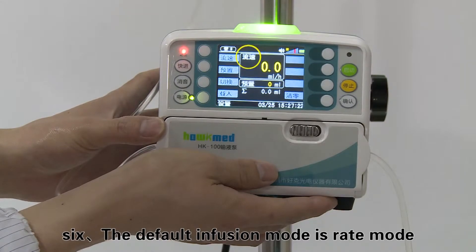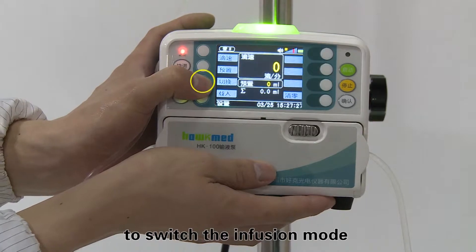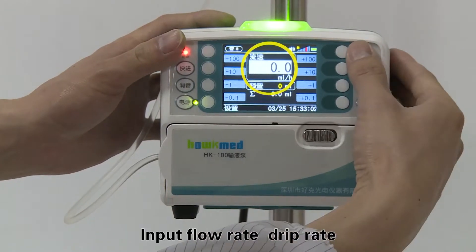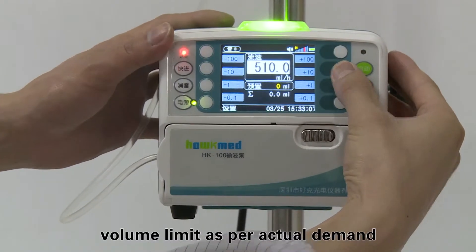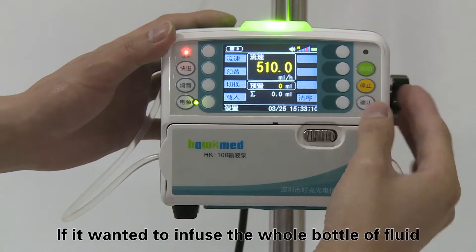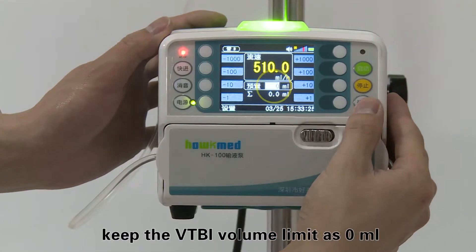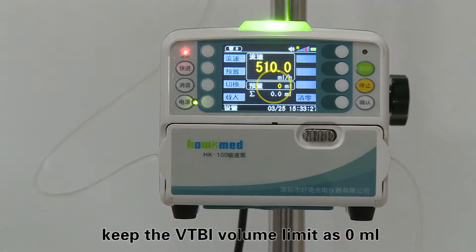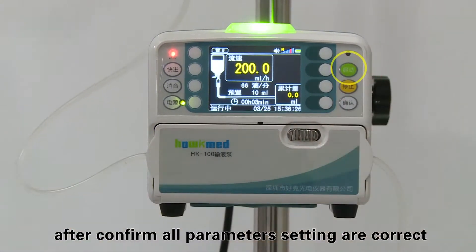Step six: the default infusion mode is rate mode. If drip mode is needed, press the switch key to switch the infusion mode. Input the flow rate, drip rate, and volume limit as per actual demand. If you want to infuse the whole bottle of fluid, keep the VTBI volume limit at zero milliliters. Step seven: press the start key to begin infusion after confirming all parameter settings are correct.